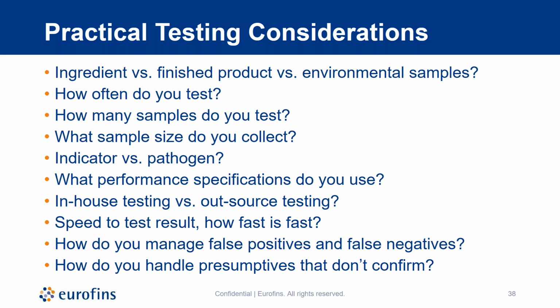Or do you set your specifications so that you look good all the time, so that you have no drama in your company because you're always meeting these specifications that really aren't very stringent? You need to question whether or not it makes sense to do pathogen testing in-house, as David alluded to, because you're going to be cultivating large populations of pathogens. Even if you're doing indicator testing, the odds are you will be growing pathogens in that in-house laboratory. This is a biosecurity threat for the facility, and this is one reason why many companies decide to outsource their pathogen testing, because they don't want to have gigantic populations of pathogens anywhere near a production floor.